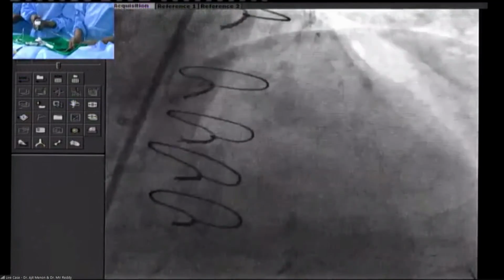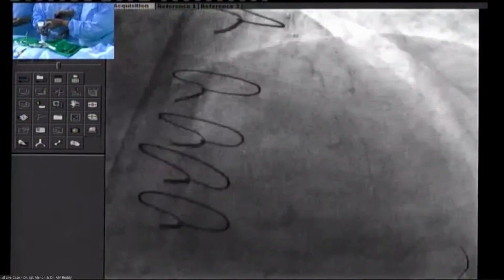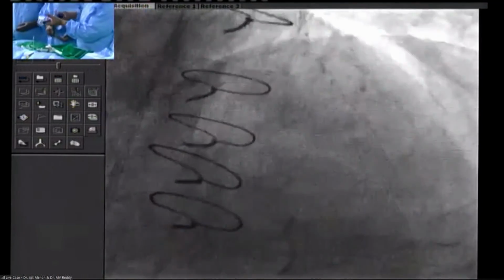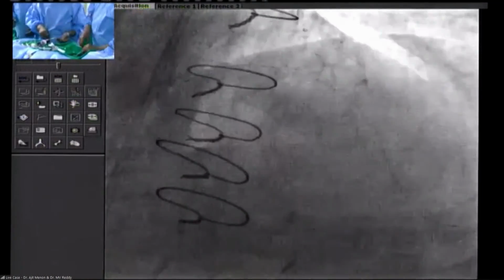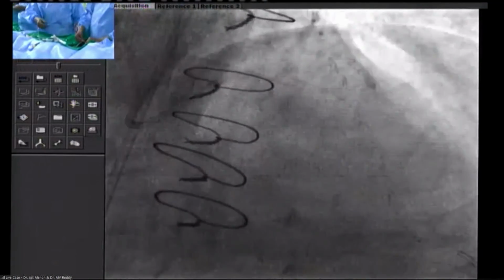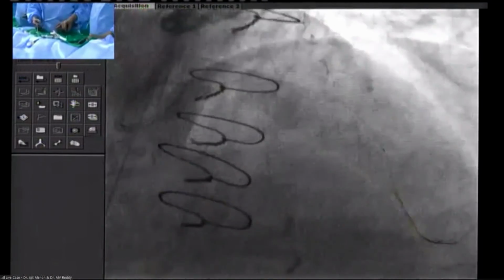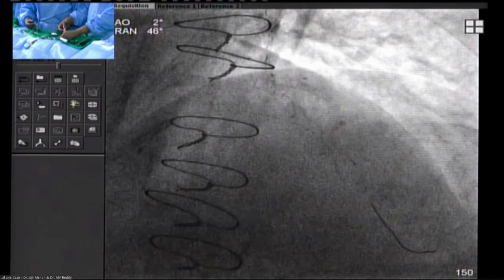Okay, go. Wait. The part that I don't understand is why there was no competitive filling down the Lima. That I don't fully understand. Give me 2.5 balloon. That's something which even we couldn't figure out.